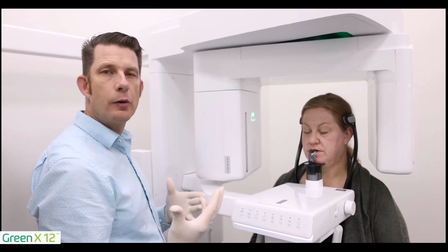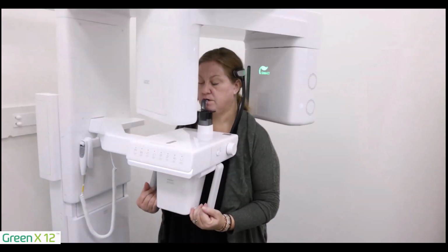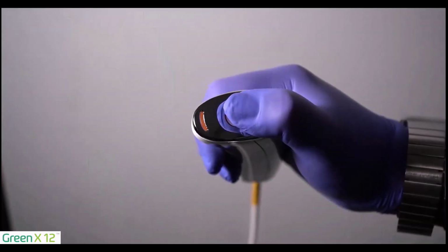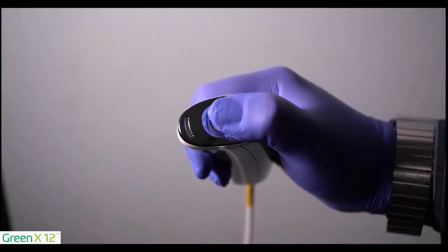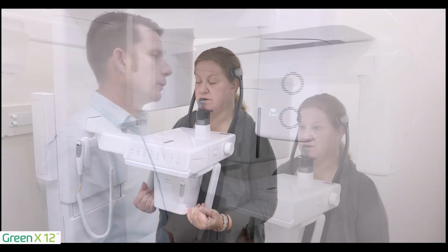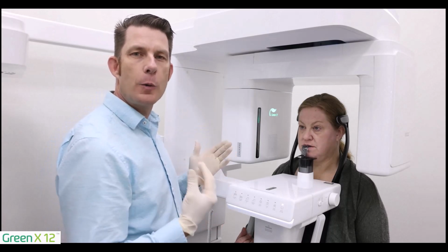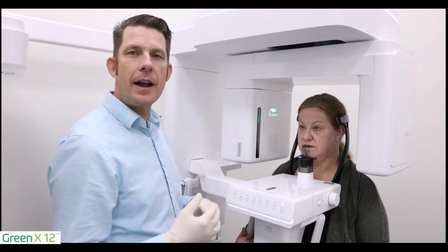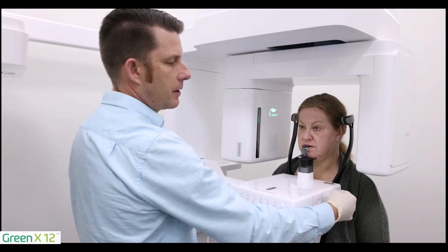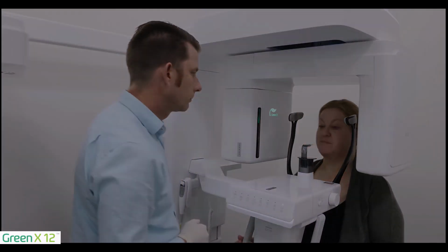We'll now step out of the room and capture our image. Hold the button until the image acquisition is fully complete. Image capturing is complete. Please wait a moment. Once image capture is complete and the overhead stops rotating, we can let our patient out of the device. I'm going to go ahead and release the temple supports by opening them here with the wheel. We can go ahead and have our patient step out of the machine.